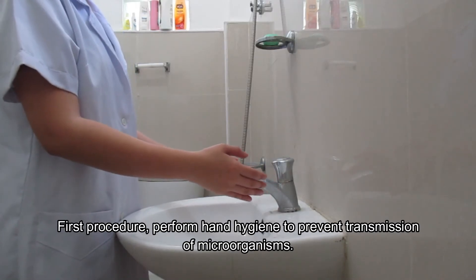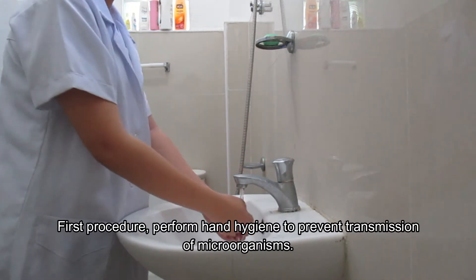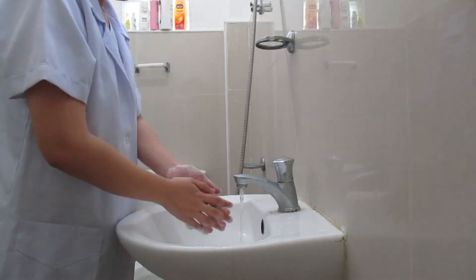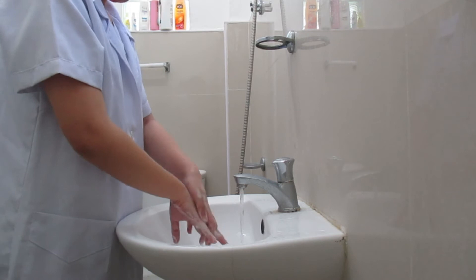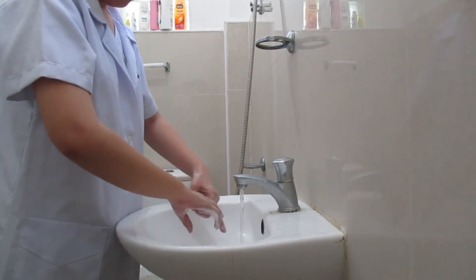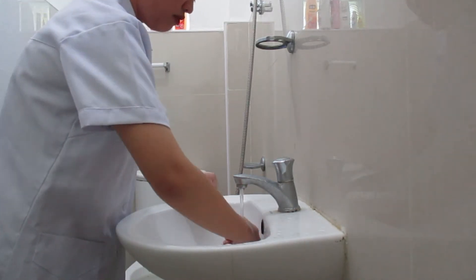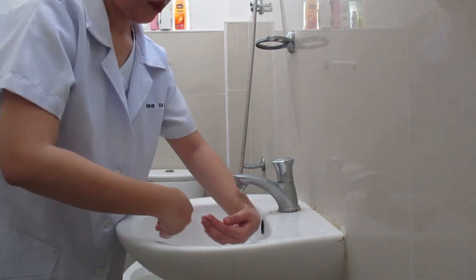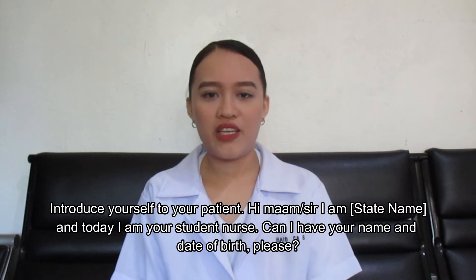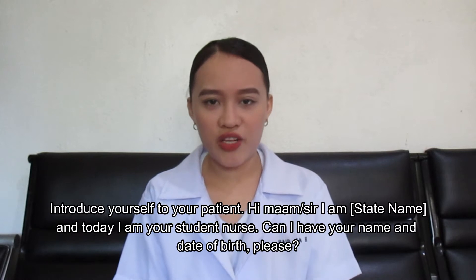Perform hand hygiene to prevent transmission of microorganisms. Introduce yourself to your patient: 'Hi, I am Baid Silastian and today I am your student nurse.'